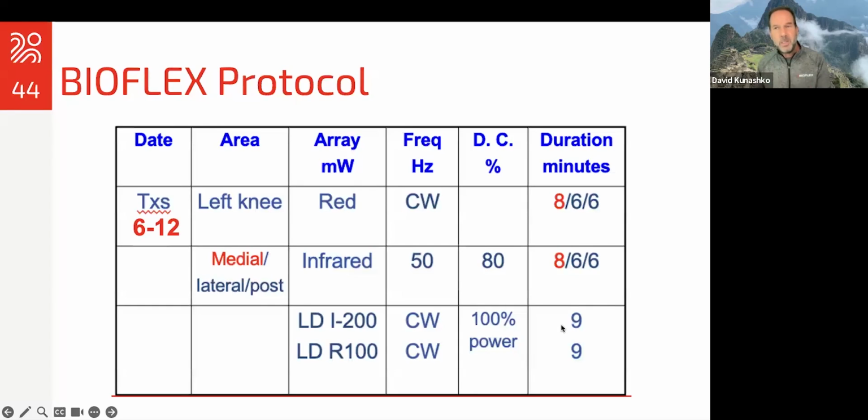I personally like a little bit lower power and hold it for longer. I know it's kind of a pain because you're treating the patient for longer, but the treatment time is actually more beneficial than more power because you have longer time that those photons are going in.